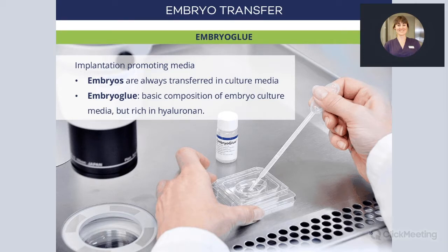It sometimes helps cells interact with each other. And some studies state that hyaluronic acid concentration increases a lot before implantation, and when the embryo has already implanted, it decreases. So it does make some scientific sense to think that this media could somehow slightly improve the adherence of the embryo to the endometrium.